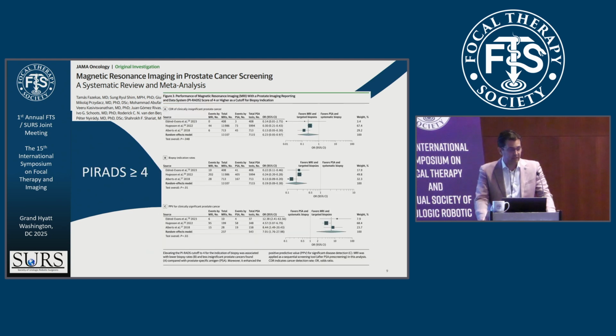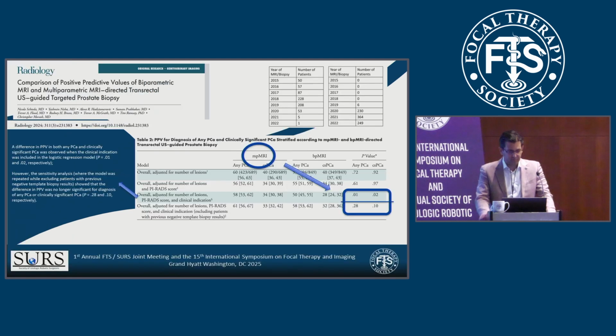And this just reflects the same thing. Another area of research is biparametric versus multiparametric for screening. I think everyone needs to understand there's a difference between a diagnostic and a screening MRI, and they serve very different purposes. If you're obtaining a multiparametric MRI before every patient undergoing a biopsy, that may be excessive if you have a throughput problem.